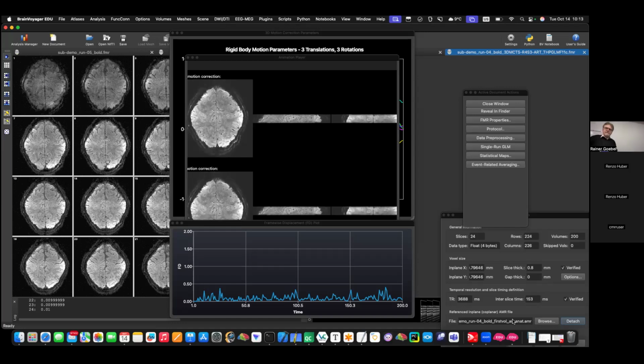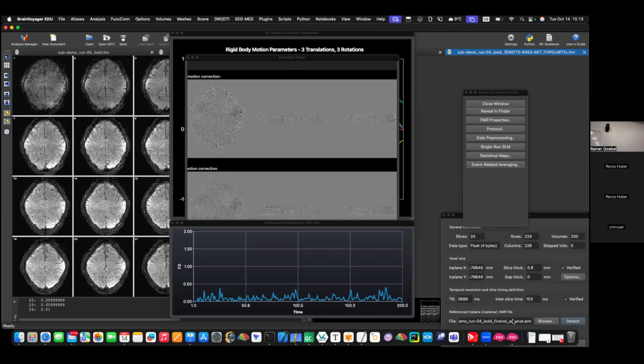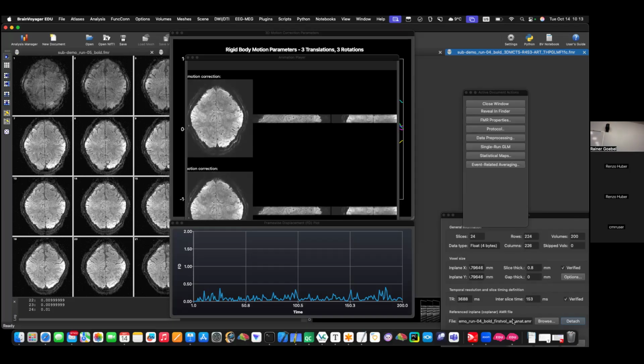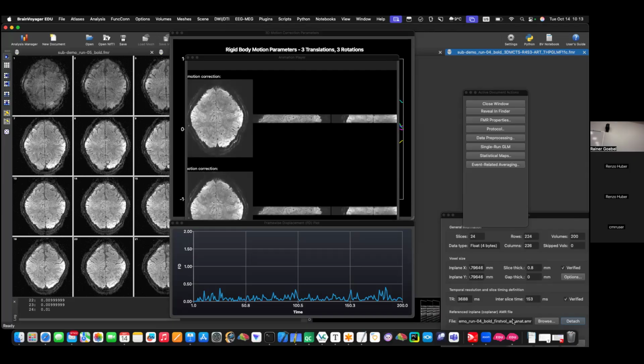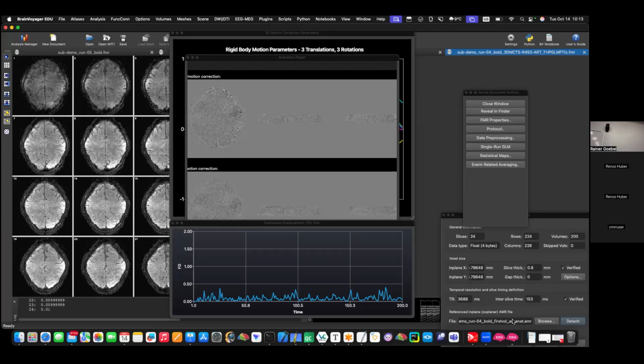I was wondering, just to check if I got that theoretically right, there will be more interpolation in run 1 and 2, and less so in the other runs? Yes. But if you would use, let's say, the mean over all runs. This we do in a moment. But we use only runs 3, 4, 5, 6. You can use all 6, it's not a problem.